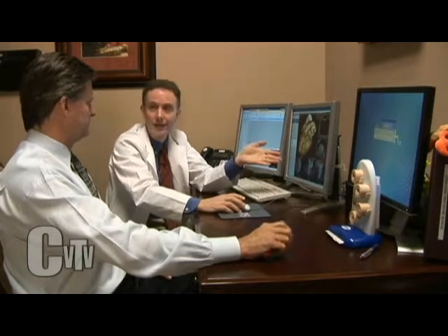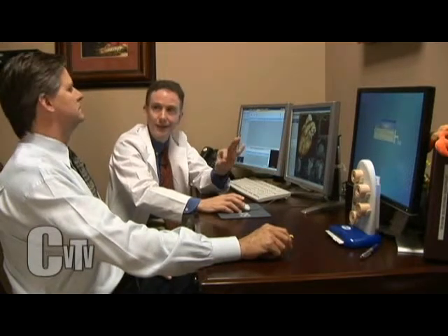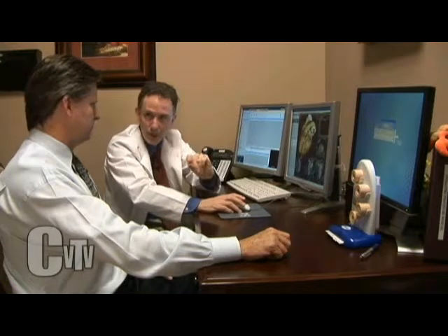But interestingly, when we look at other techniques to understand the heart, like stress testing, we can give up to 30 millisieverts. Like nuclear stress testing. If we do a heart catheterization, we're going to get the same amount of radiation, but dramatically less information. So this is a condition that kills half of us. There is radiation exposure, but the risk is so minuscule versus the dramatic information that helps us understand whether you've got the disease or not and detect it early.